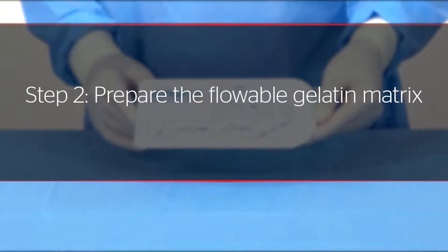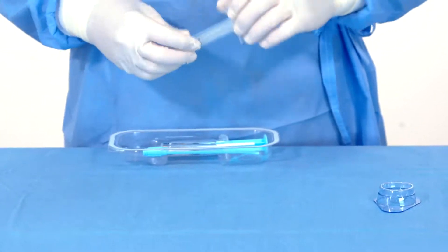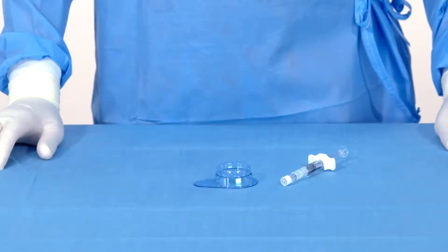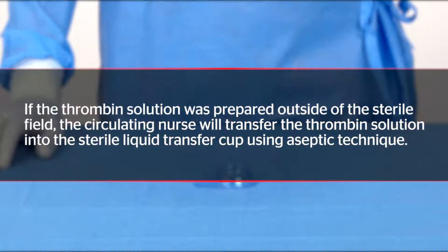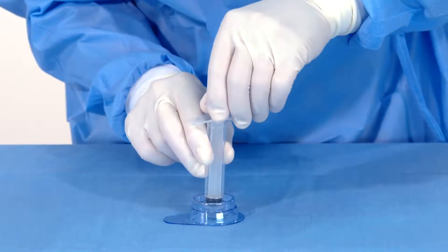Step 2: prepare the flowable gelatin matrix. Open the sterile packet and remove the liquid transfer cup, the empty syringe, the blue syringe with gelatin matrix, and the two applicator tips. Because the correct amount of thrombin has been reconstituted for use, simply transfer the thrombin solution into the sterile liquid transfer cup. If the thrombin solution was prepared outside of the sterile field, the circulating nurse will transfer it using aseptic technique. Surgiflo is ready to use in 30 seconds or less. Once liquid thrombin is delivered to the sterile field, draw all of the solution into the empty sterile syringe.